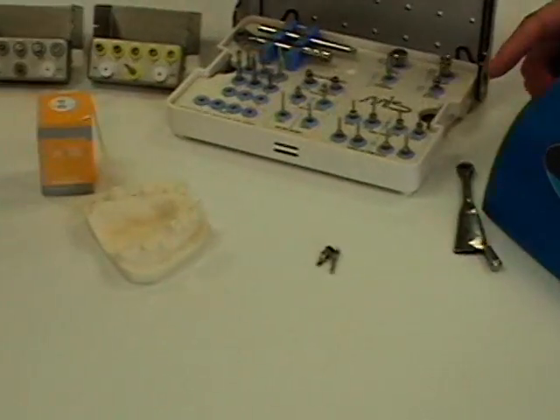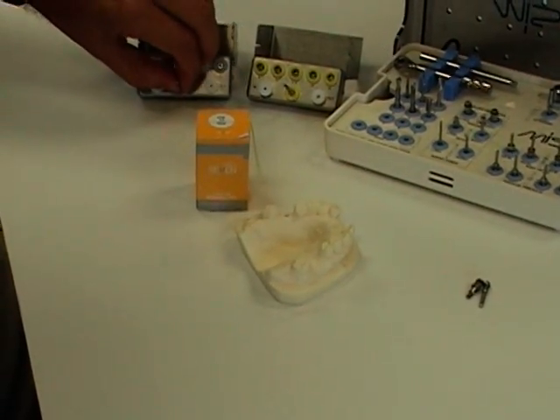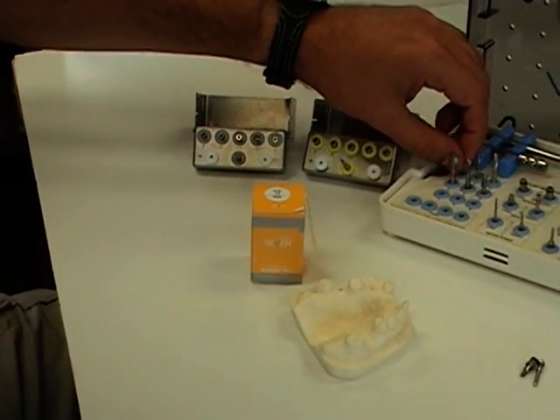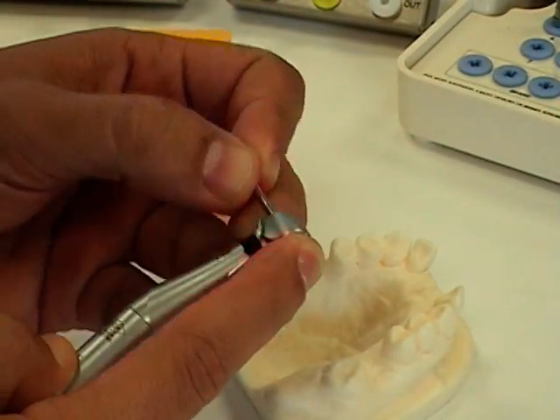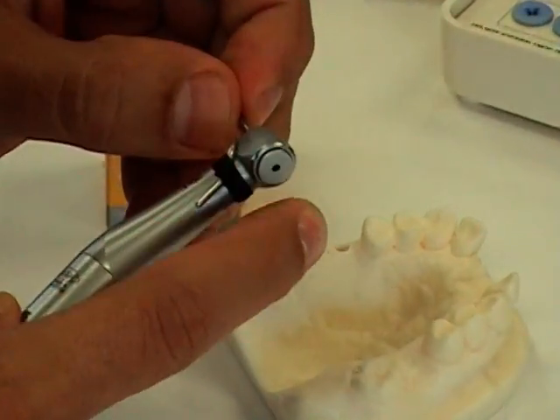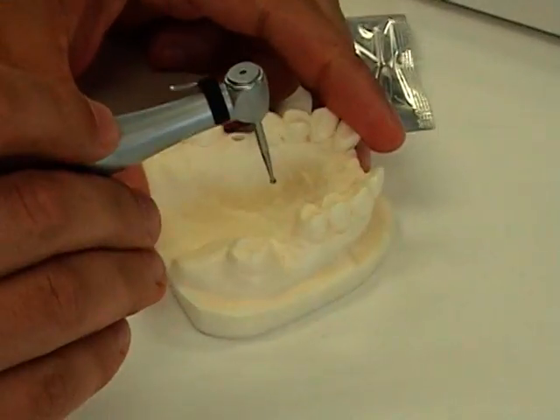First we have to drill the osteotomy. We're going to start with the marking drill from the MIS surgical kit. First drilling with the marking drill.